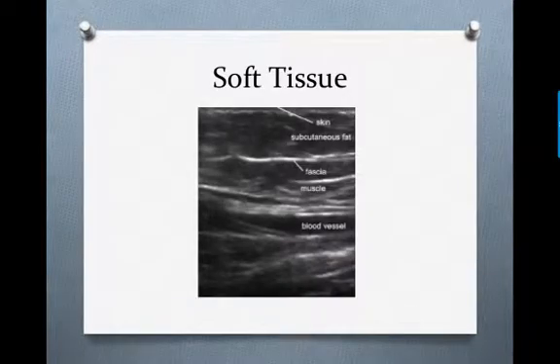This is an example of normal soft tissue on ultrasound. You can see skin, followed by subcutaneous fat, fascia, muscle. Blood vessels may or may not be seen, and bone would appear bright white and would be at the bottom of the image.